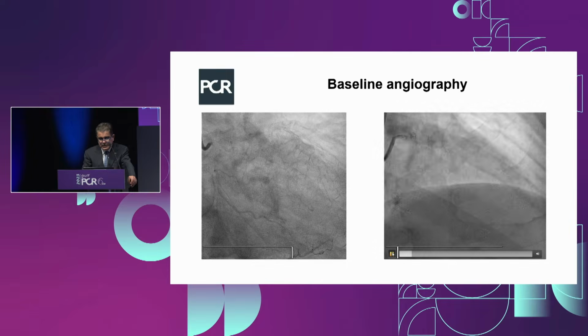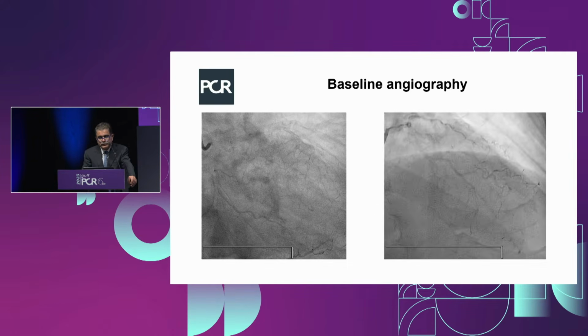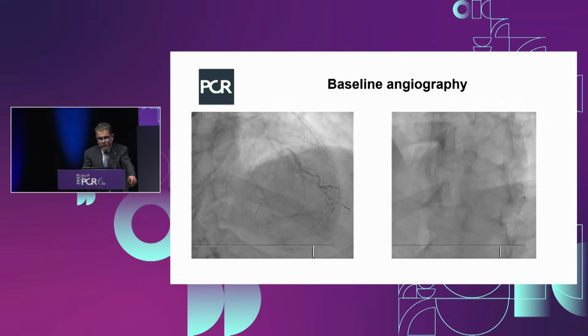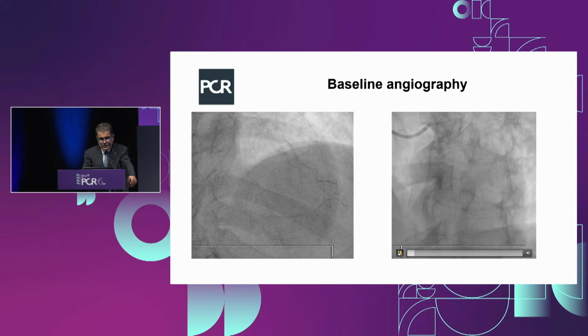So it's pretty complex calcified lesion affecting multivessel. Different views. That diagonal should, I think, it's large and should not be ignored as well. So we should pay attention to that.